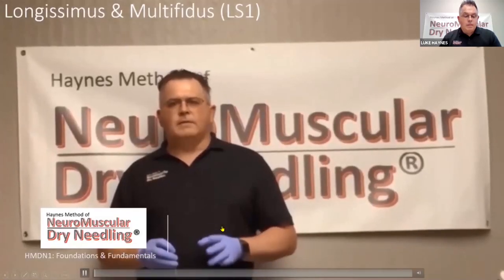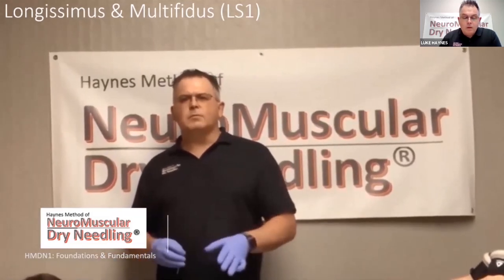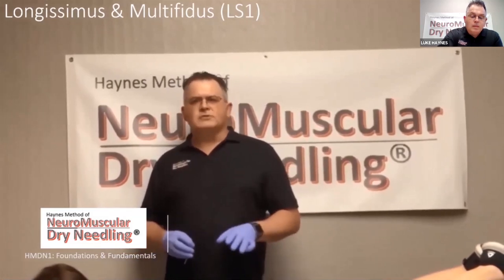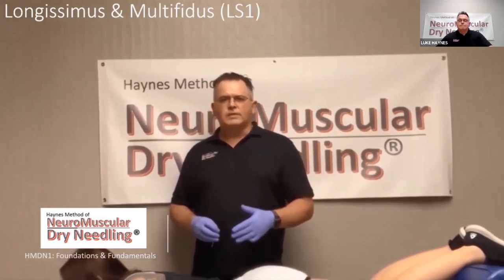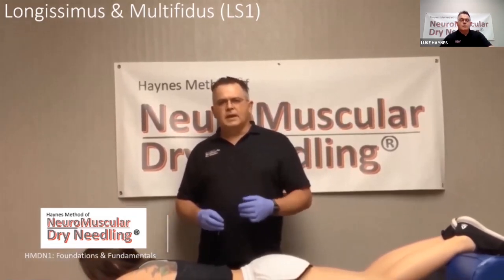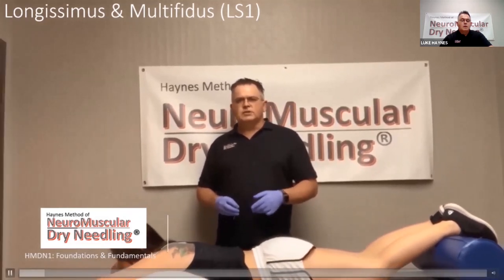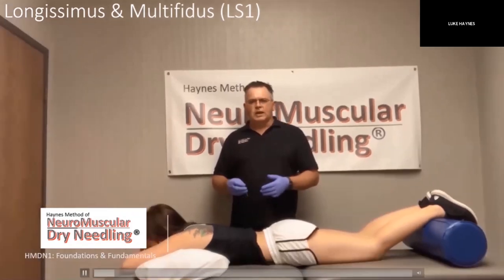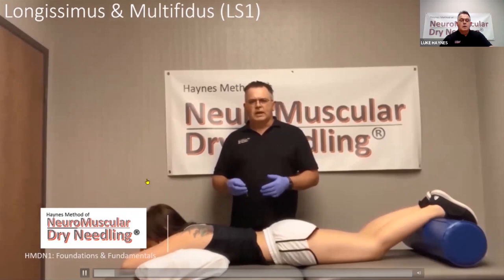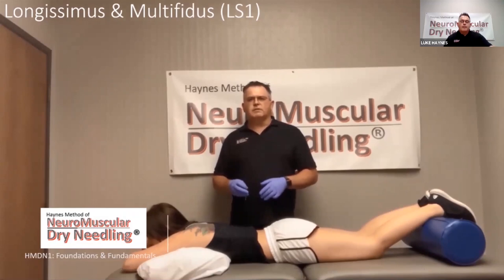In the lumbar spine, for the longissimus and the multifidus, the patient is going to be here in the prone position. Needling will be 40 to 60 millimeters with a backdrop onto the lumbar lamina. We're going to palpate for the spinous process of L4, the level of the iliac crest. Needle inclination will be 1 finger breadth lateral from the spinous process. It should be a 15 to 20 degree anterior, medial, and caudal angulation in each plane, perpendicular to the skin surface or relative orientation of the vertebra to contact the base of the spinous process on the lamina.